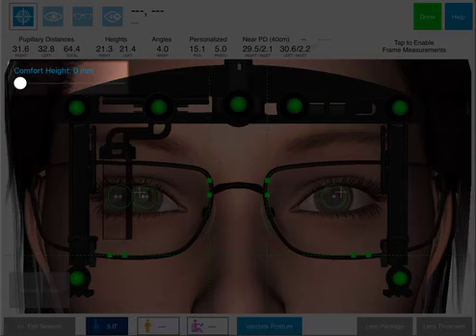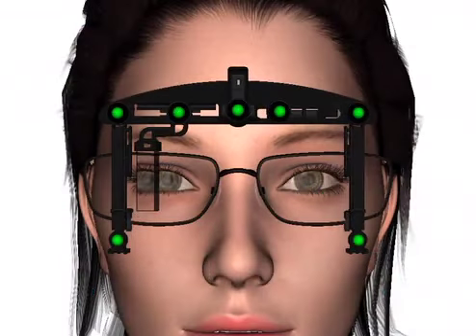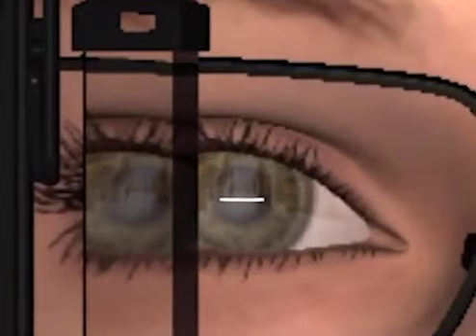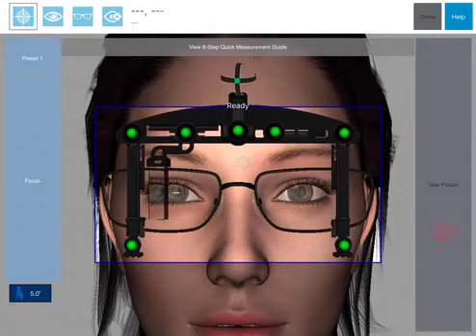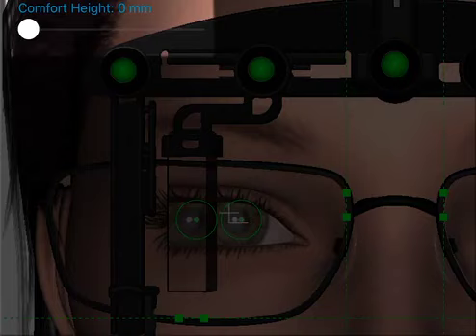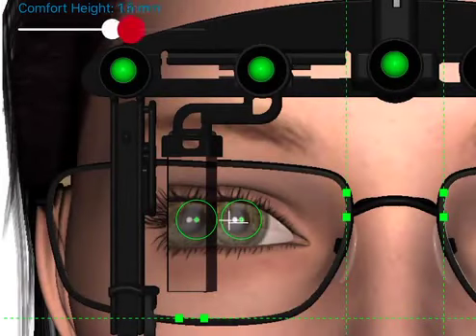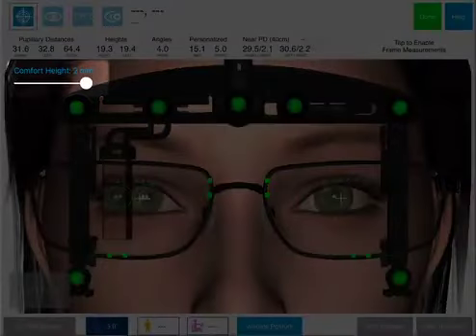If you'd like to closely mimic your manual heights instead due to customer habits, we recommend the following test to establish the comfort height value to use. When practicing among staff members, dot the lens manually with a marker in the same posture that was captured with the OPD. Take a measurement picture and observe the vertical offset between the manual dot and the white fitting cross marker. Slide the comfort height slider until the two are aligned vertically, and this comfort height value can be set going forward for all future measurements.